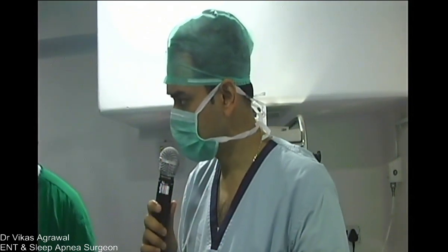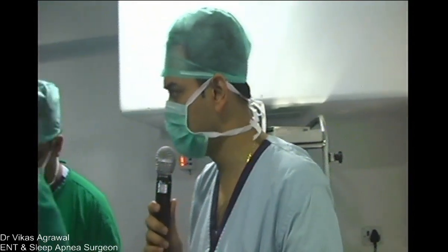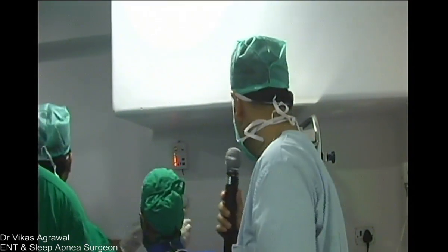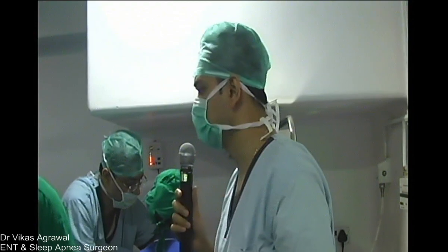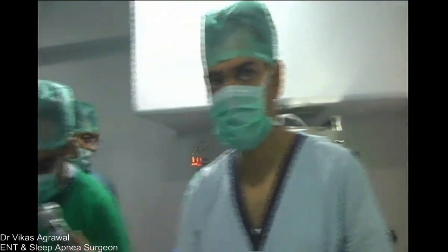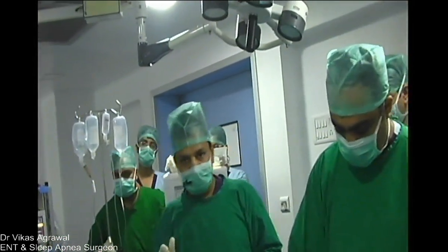So, Dr. Vikas, any experience with radio frequency? Because I have never used radio frequency. I've used coblator, but there's a question from the house in terms of whether you prefer radio frequency in this patient. I am a fan of coblation. Sure. But radio frequency for the turbinates is good. Right. Radio frequency is good for the turbinates.